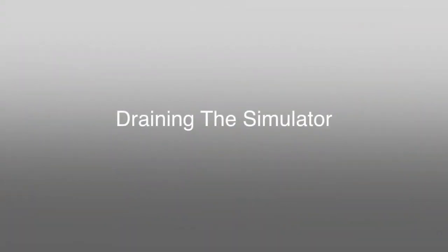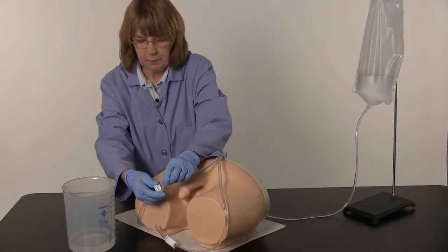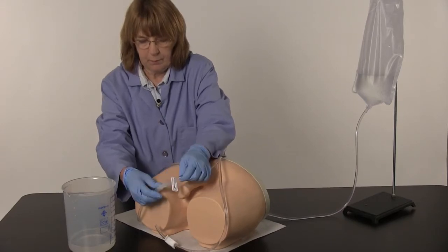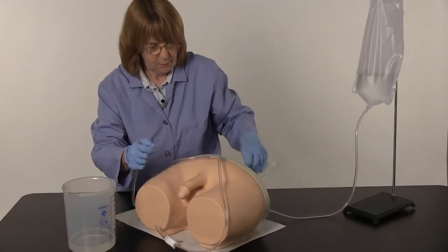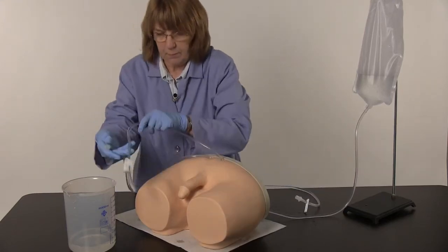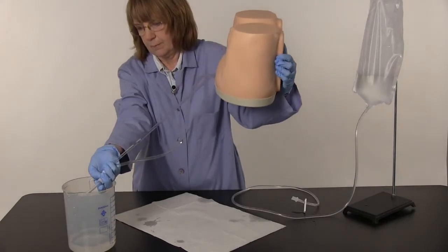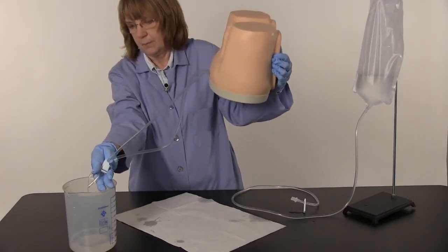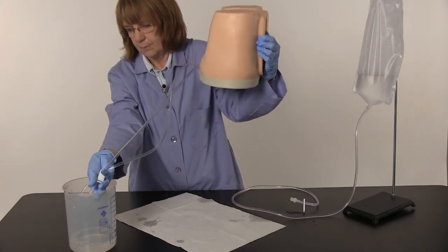Draining the Simulator. Perform this procedure near a sink or with a water-safe basin. Slide the clamp closed on the fluid administration set. Disconnect the quick disconnect fittings. Turn the simulator over onto its plastic base. Elevate the simulator and place the tubes in a water-safe basin or sink. Open the pinch clamp on the drain tube and allow the water to drain from the simulator's tubes.